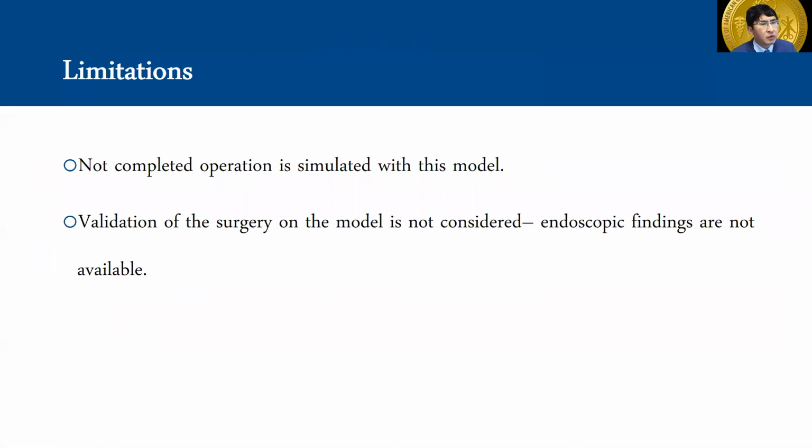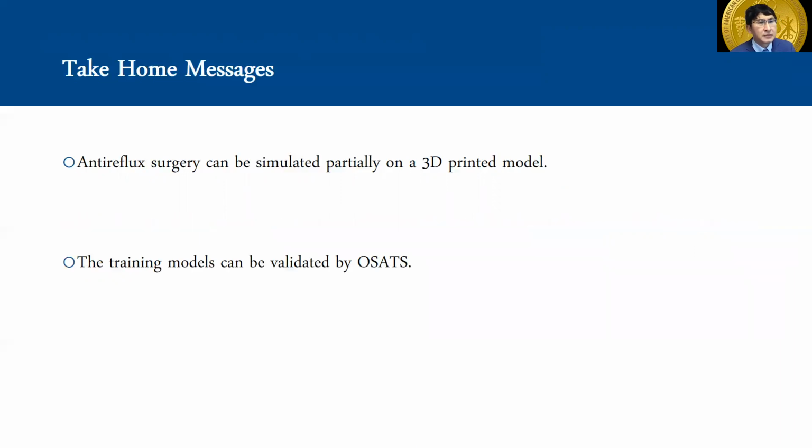We do have quite a few limitations, like not all the steps in the operation are simulated with this model, and we failed to observe the effect of the fundoplication as conventionally observed with the endoscope in the OR. We can make a teeny tiny hole in the future to observe the wrap, hopefully.